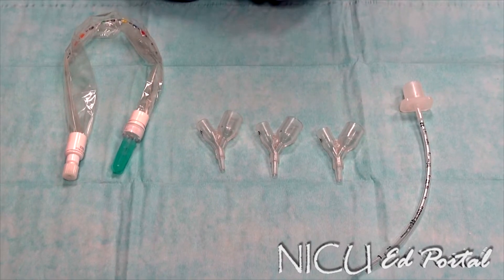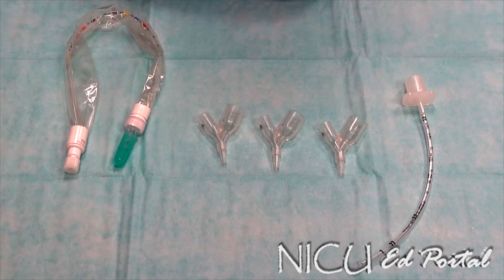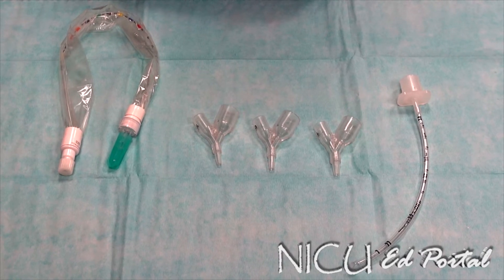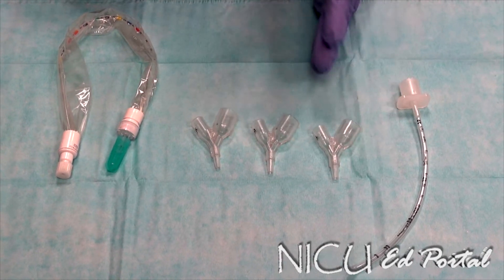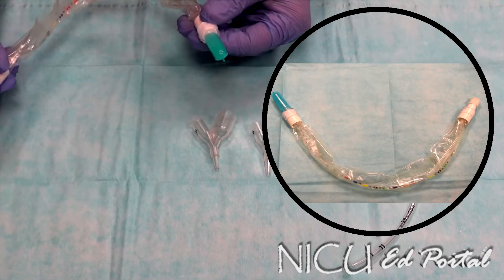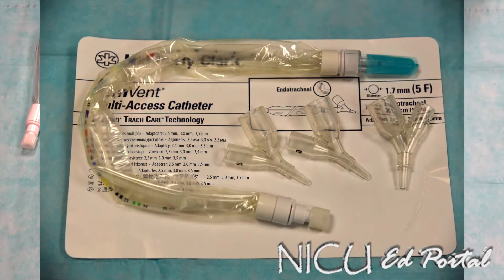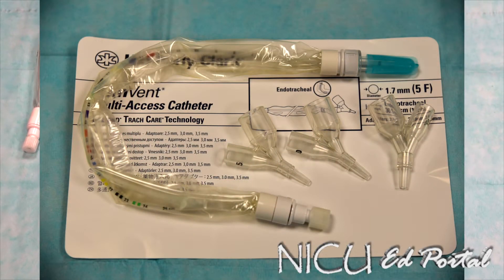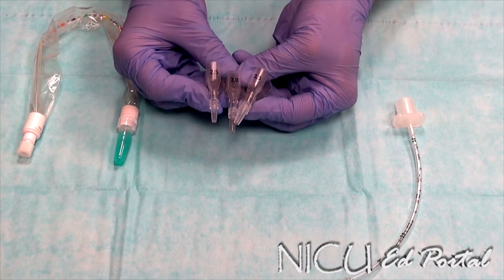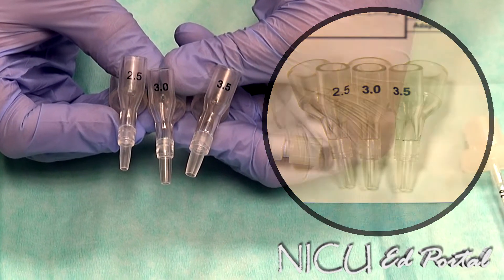In this video, we are going to demonstrate surfactant administration through a catheter. Here at our institution, we use a catheter kit shown here. The catheter kit comes with a 5 French catheter to administer the surfactant through. It also comes with three different size adapters for the appropriate size ET tube: a 2.5, a 3.0, and a 3.5.